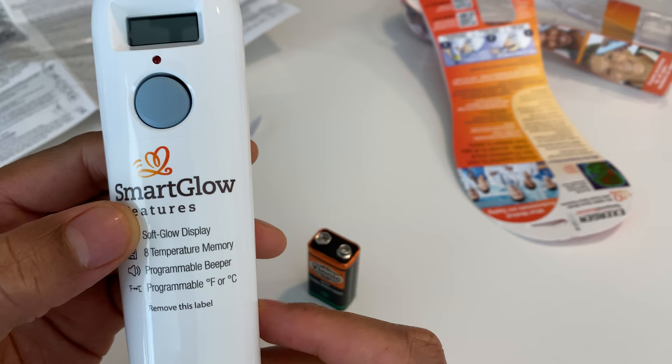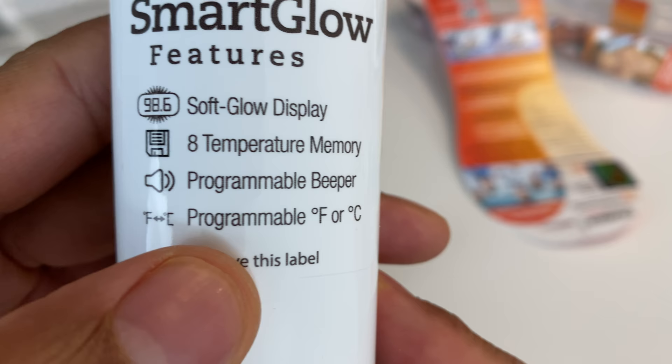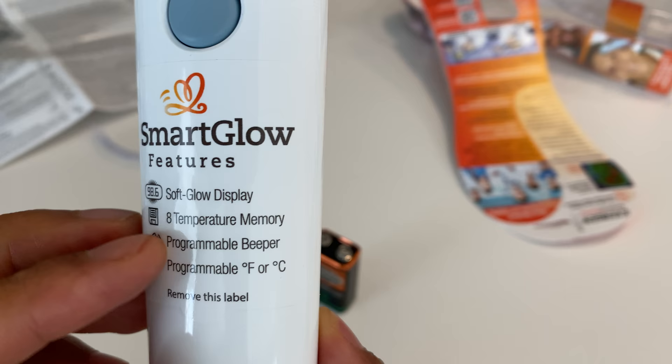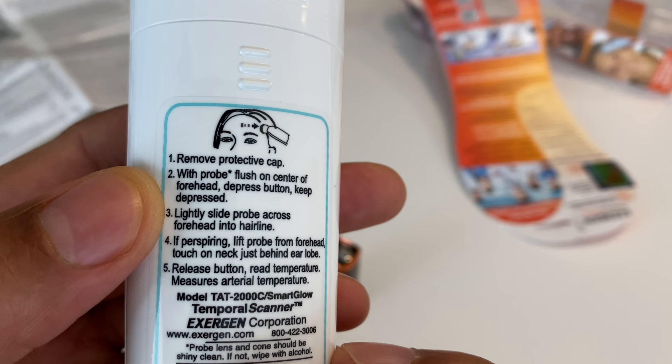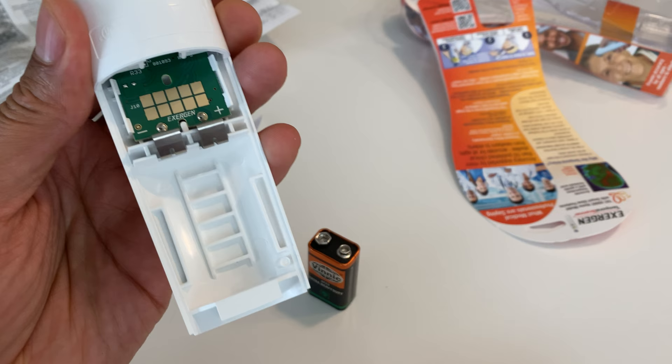The device has a sticker on it with more reading material: Smart Glow feature, soft glow display, eight temporal memory, temperature memory, programmable beeper, programmable for Fahrenheit or Celsius. It says to remove this label. I'll do that a little bit later, but now I'm going to put the battery in and go through the instructions before actually using it.